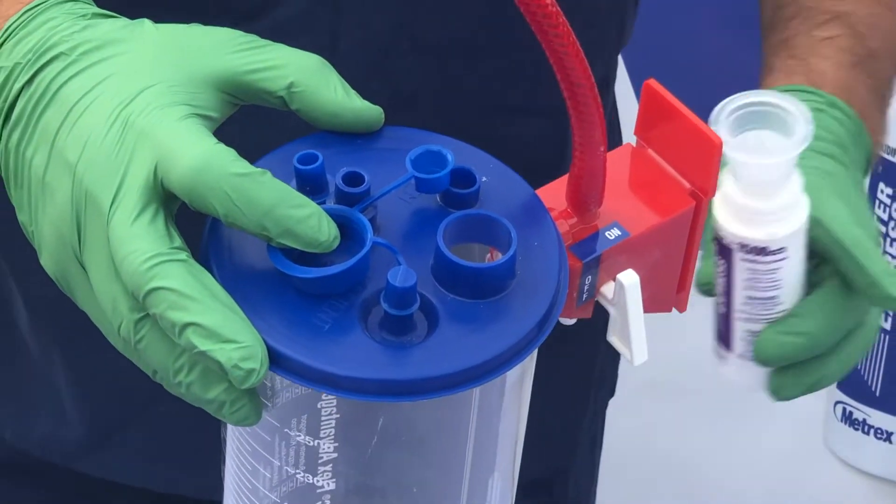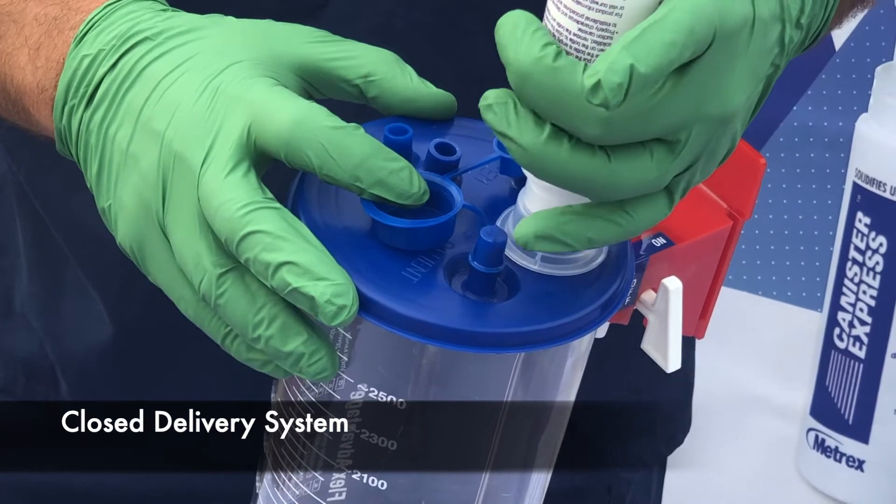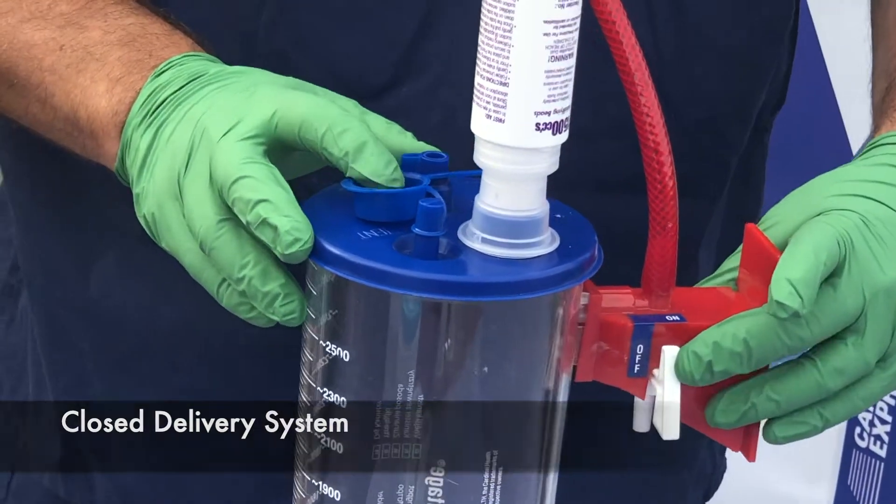Then the procedure takes place and fills the suction canister with potentially hazardous liquid medical waste, and the total volume of waste can be recorded.